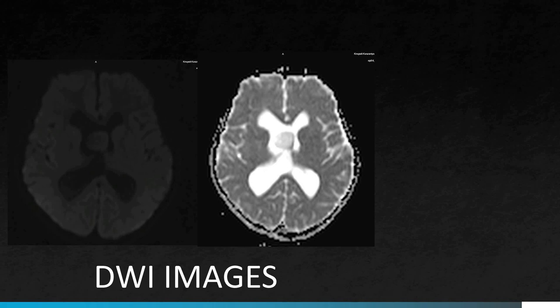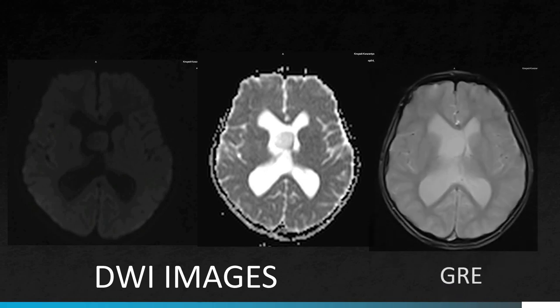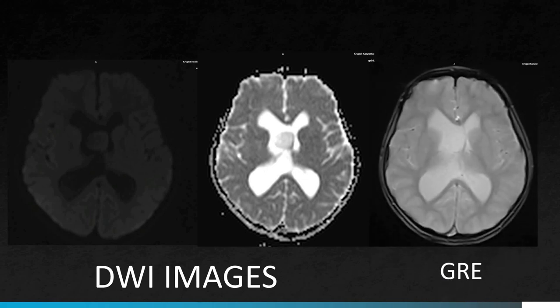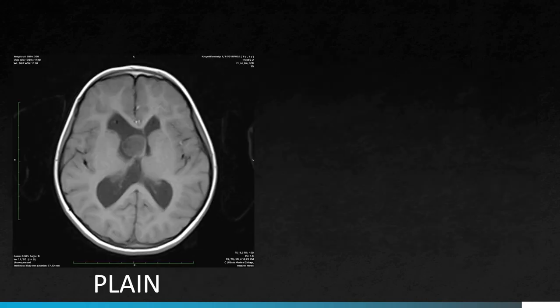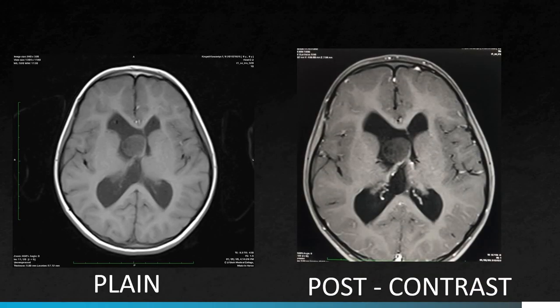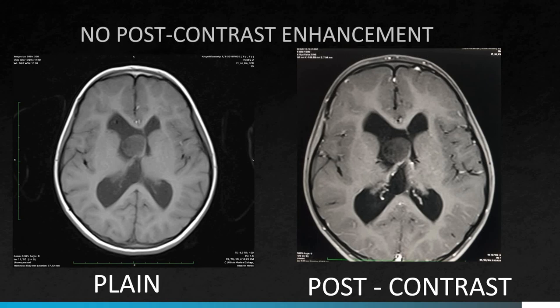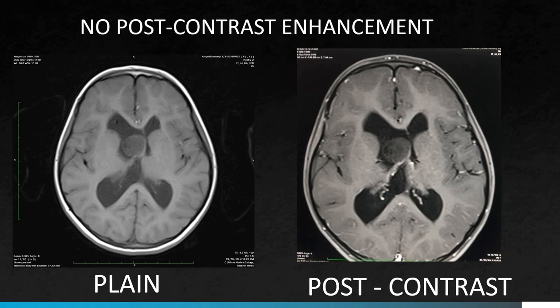Diffusion weighted images do not show any restricted diffusion. GRE images do not show any blooming to suggest any calcification or hemorrhage. Post contrast images do not reveal any contrast enhancement.